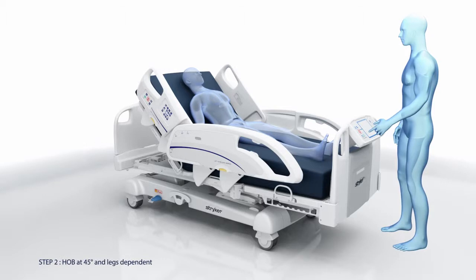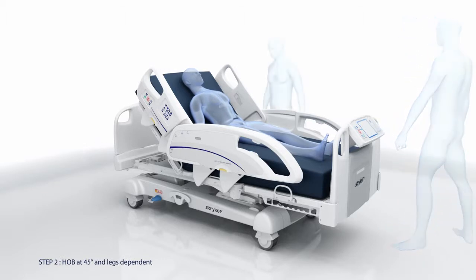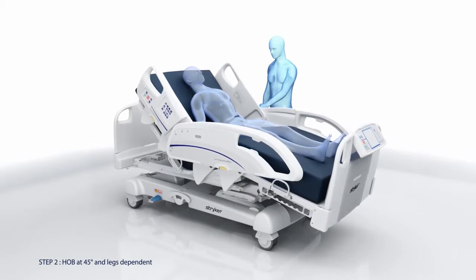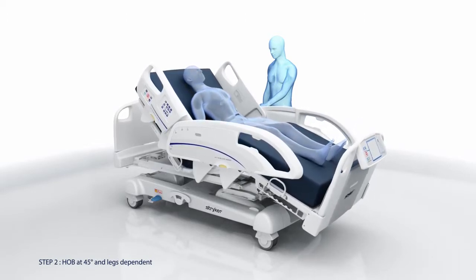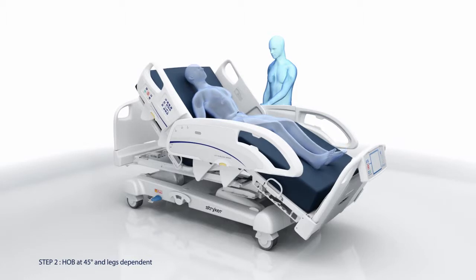Step 2 of early mobility is to continue to keep the head of bed at 45 degrees and have the legs dependent. This is important because a flat lying position creates a shift of fluids away from the legs. Placing the legs in a dependent position will train the body to accommodate the shifting of the fluid back to the legs, helping prepare the patient for ambulation. Without this step, the patient may experience a drastic drop in blood pressure, causing them to become lightheaded or pass out.